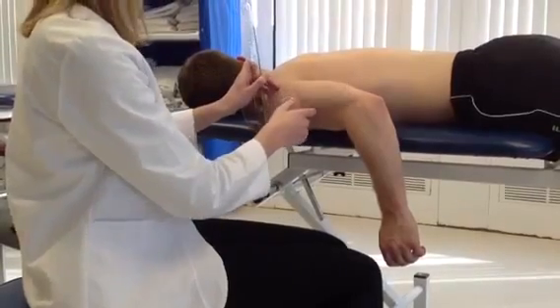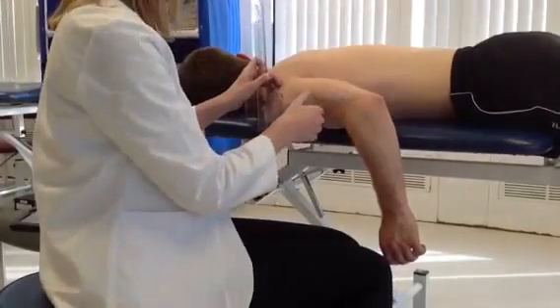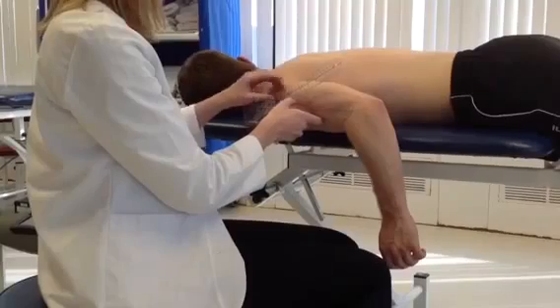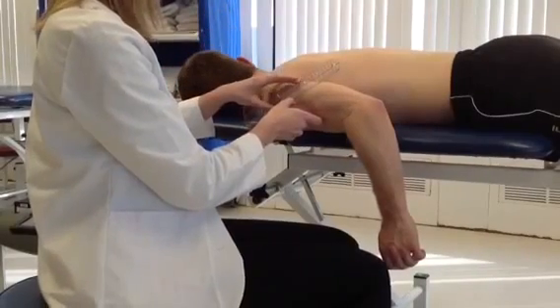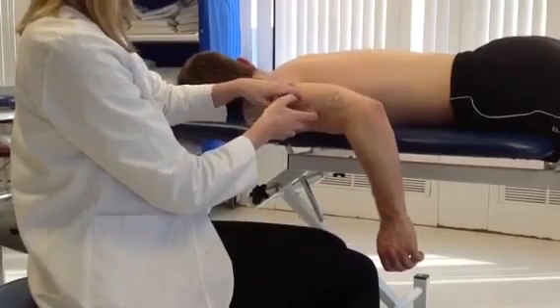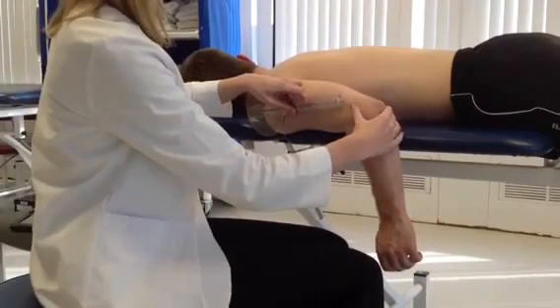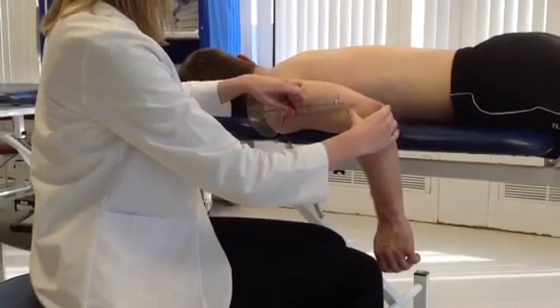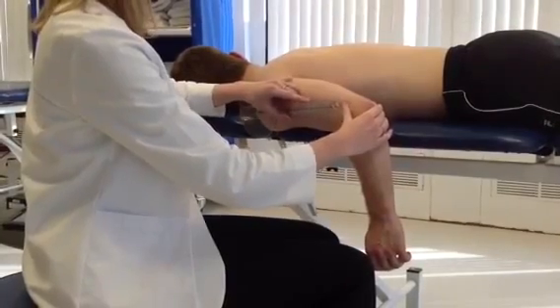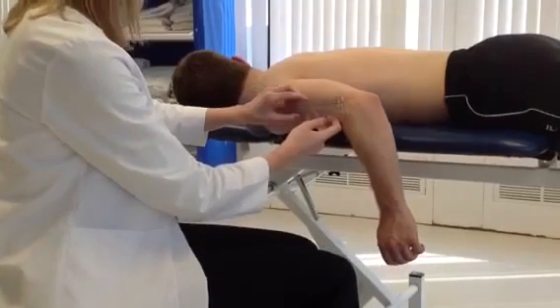stationary arm and line it up with the mid-axillary line of the thorax, so just right down the center of your body. And then I'll line up the moving arm with your humerus, midline of your arm, and I can check that I have the correct line up with that by palpating for the lateral epicondyle of the humerus. So right about there is where I'll be keeping my moving arm. So if you can go ahead and do the motion on your own this time, and I'll measure that.